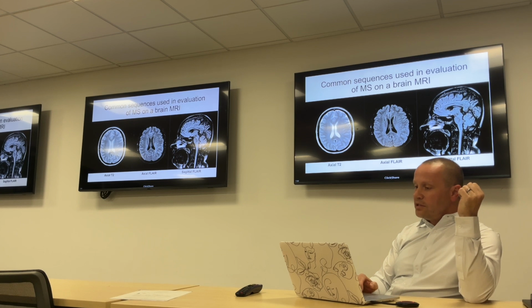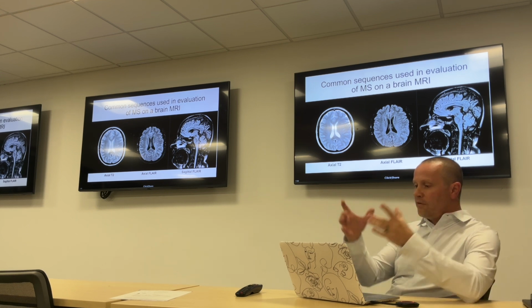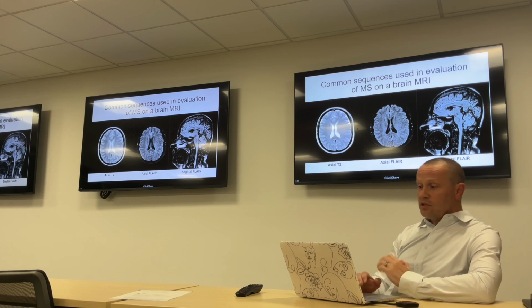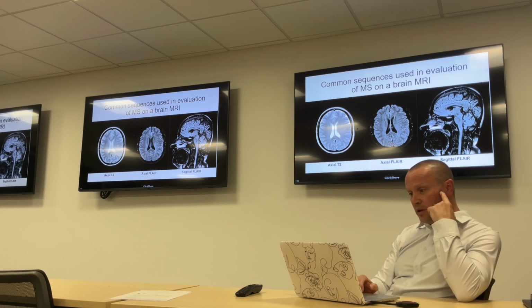We can see on the midline sagittal picture also the midbrain, which is right here. And this is the brainstem. This is the pons and the medulla. The pons is this kind of pregnant belly that sticks forward, and the medulla is this triangular shaped funnel that lets the nerves communicate down to the cervical spinal cord. So the brain communicates straight down through the foramen magnum to the cord. The midline sagittal image is useful for a lot of other reasons too. I won't get into it, but these are the key anatomic things that we look at.